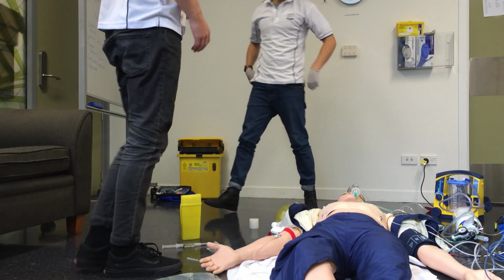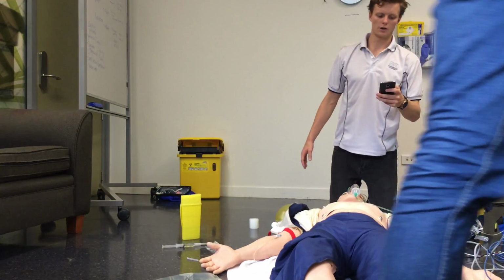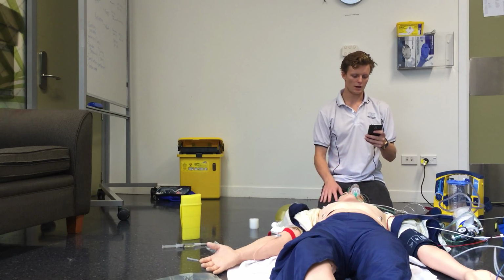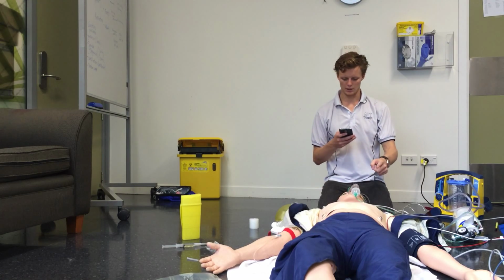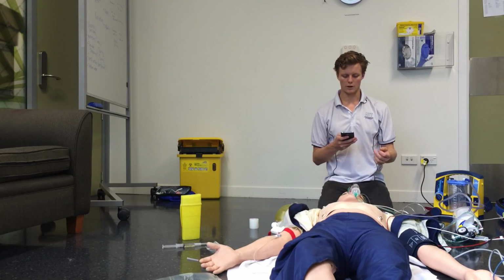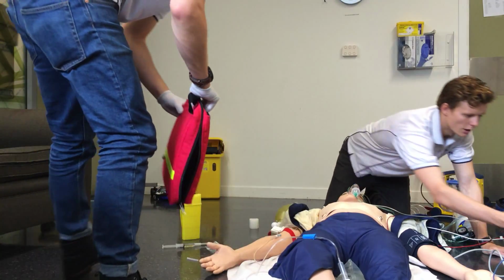Okay, do you want to start tidying up, and I'm going to go through my RSI assistant checklist? ICP is 2 minutes away. 2 minutes. Okay, so looking at my checklist, we have nasal prongs attached but not on. I'm pre-oxygenating with the reservoir mask. We've attached monitoring. We've got SpO2, ECG on, and blood pressure. Do you want to do another full set of vitals as well? Yeah, I'll just tidy up. End tidal is on.